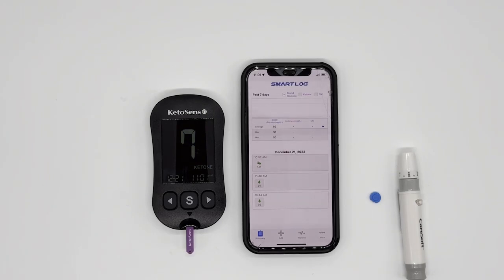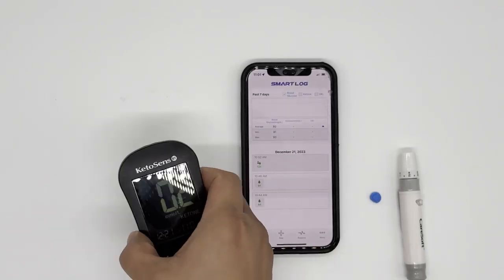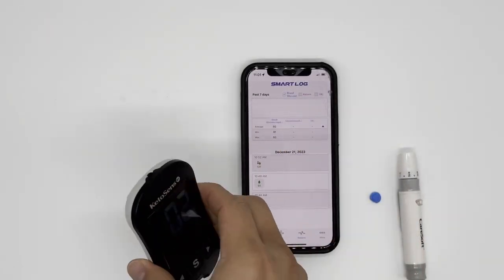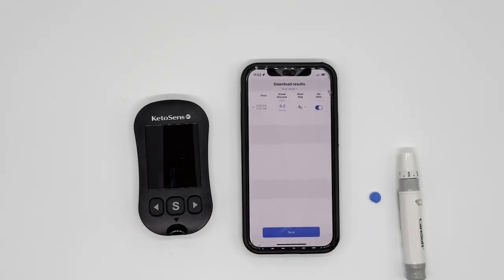After eight seconds, you will find your ketone level. It is a real-time ketone level in your body — I can see that I got 0.2. From here, when you take out the test strip, the data gets transferred over. You can use the test strip ejector to take out the strip. The Bluetooth signal triggers and the data gets transferred to your phone. From there, you can simply press 'Save.'